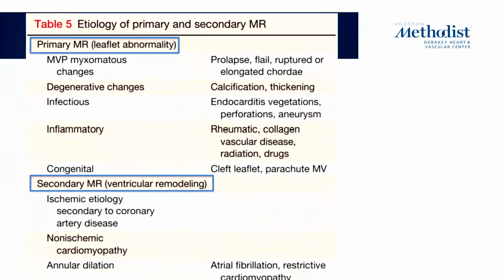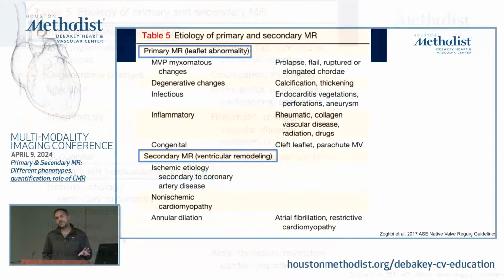So next, about lesion mechanism. Generally, we divide mitral regurgitation, as Dr. Faza said, into primary and secondary MR. I'm going to show examples of each one, but I want you to know something now. With the more advancement of catheter therapies, we're realizing that this division is kind of crude between primary and secondary, because within secondary, although we call it secondary because the valve itself is normal, quote unquote, there are different geometrical disruptions of the leaflets based on what's causing that. So some of those are labeled as secondary, but in a way they're behaving like primary.